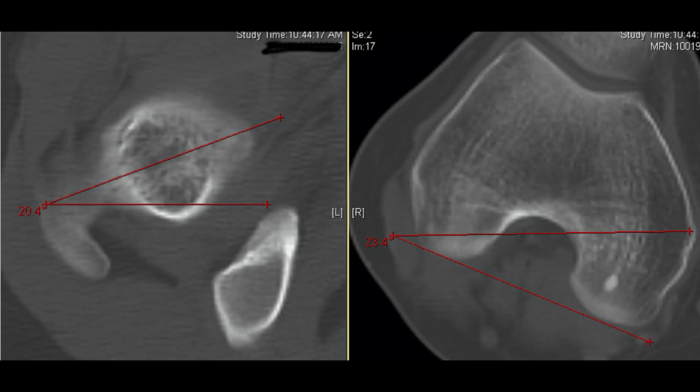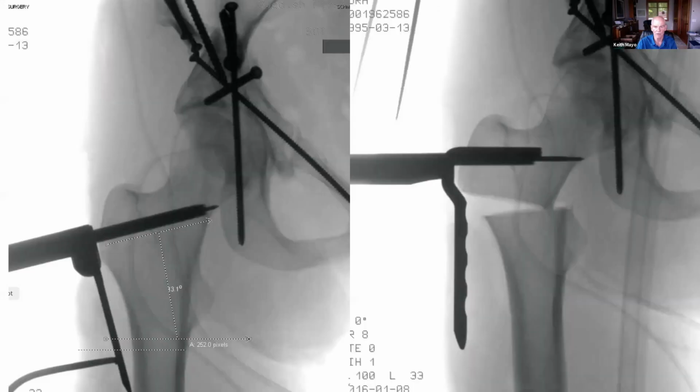And so this is her aggregate total antetorsion of over 40 degrees, with a commensurate asymmetry in medial versus lateral rotation. And so our plan was essentially to use, unfortunately, a pediatric plate for this, since her neck wasn't big enough. So I planned for approximately a 10-degree adduction or varizing osteotomy. And this is what it looked like initially. This is the longest blade that we had available, unfortunately. And we'll see where that comes in to be a problem later.